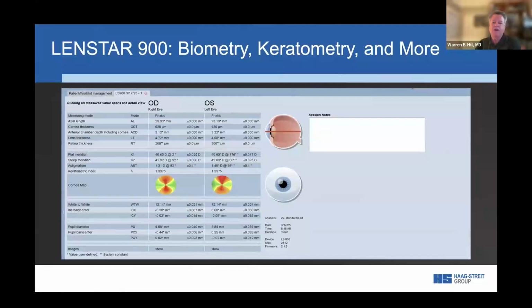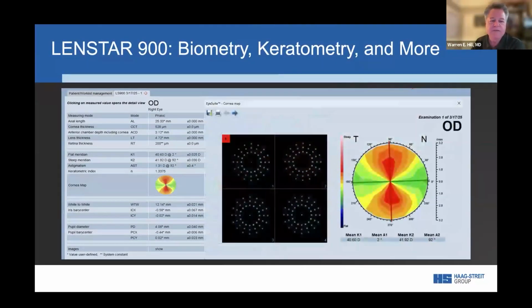Okay, so back to our measurement summary page, where we can click on the axial curvature map, and you'll get the reflected images. And here we've got a really nice looking cornea. We know that these are going to be very solid K measurements. We have the line drawn through the corneal vertex in the center of the two astigmatic lobes by the software for us.